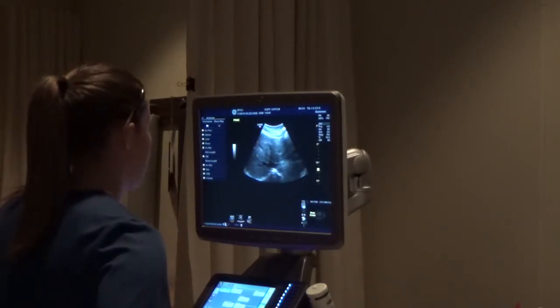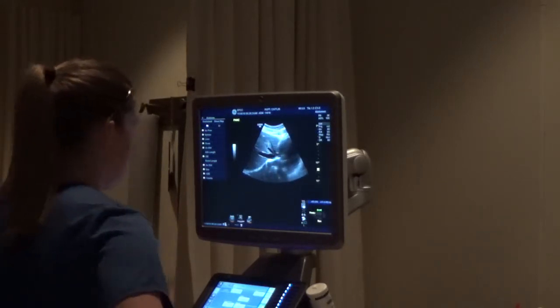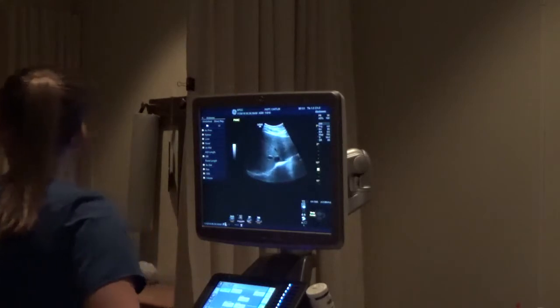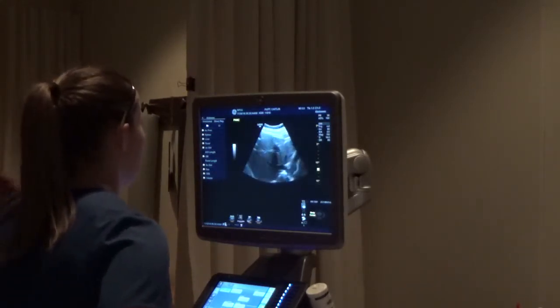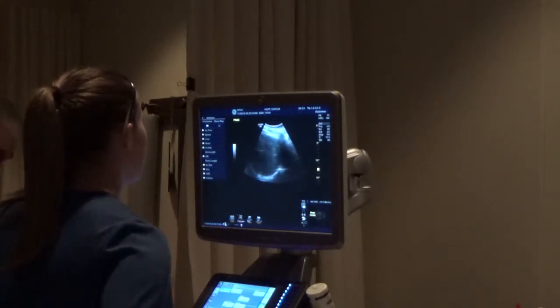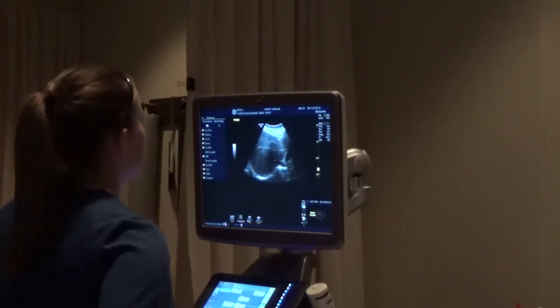And then what conditions should be ruled out regarding the hepatic veins? Budd-Chiari. And what is that? That's when there is thrombus in the hepatic veins or the IVC. Okay. You already mentioned it, but where do the hepatic veins go? Into the IVC. And then from there? They go into the right atrium of the heart. Okay. So can you show me the direction of flow in the hepatic veins?